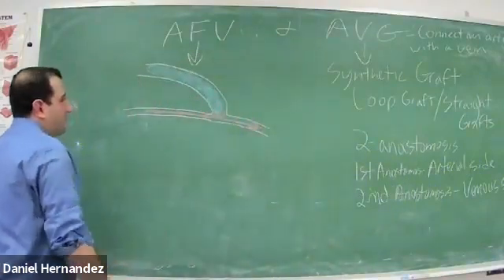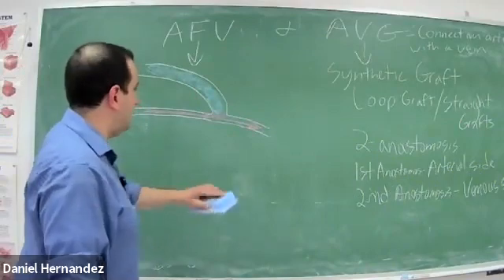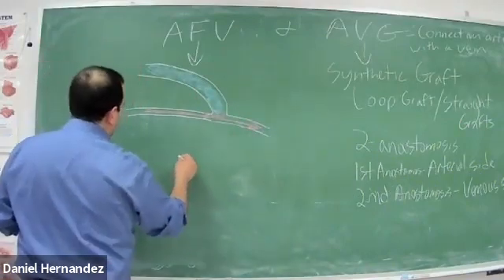So this goes along our lines of our pre-stenotic, post-stenotic waveforms.